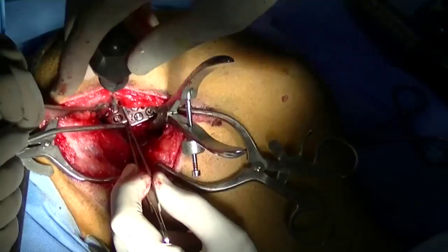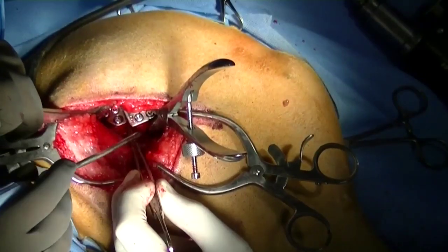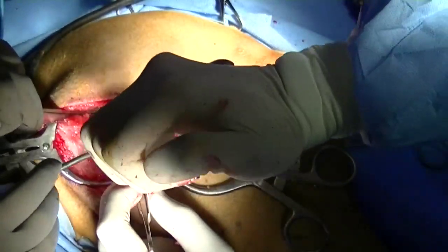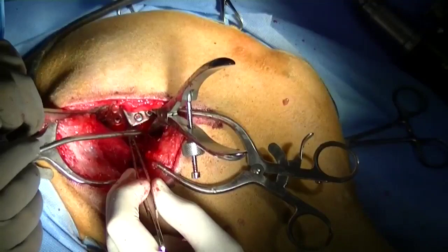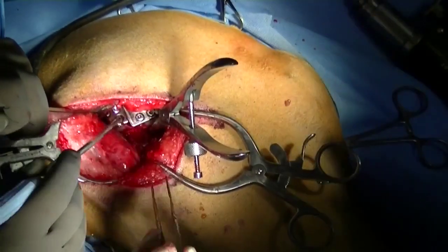The plate is then attached to the cranial segment. This post-operative radiograph shows that the screws are not entering into the pelvic canal, and I think that's important because you can develop some neurologic deficits in these patients.